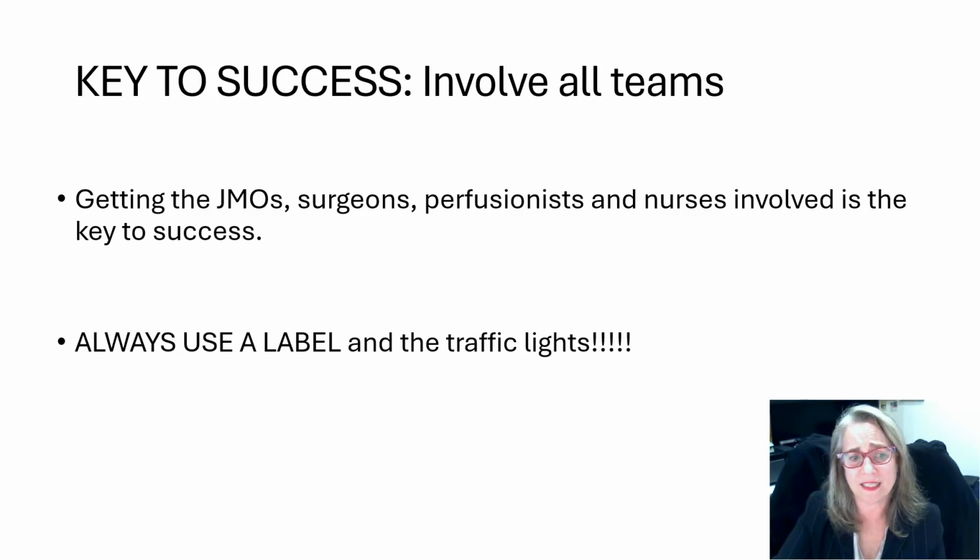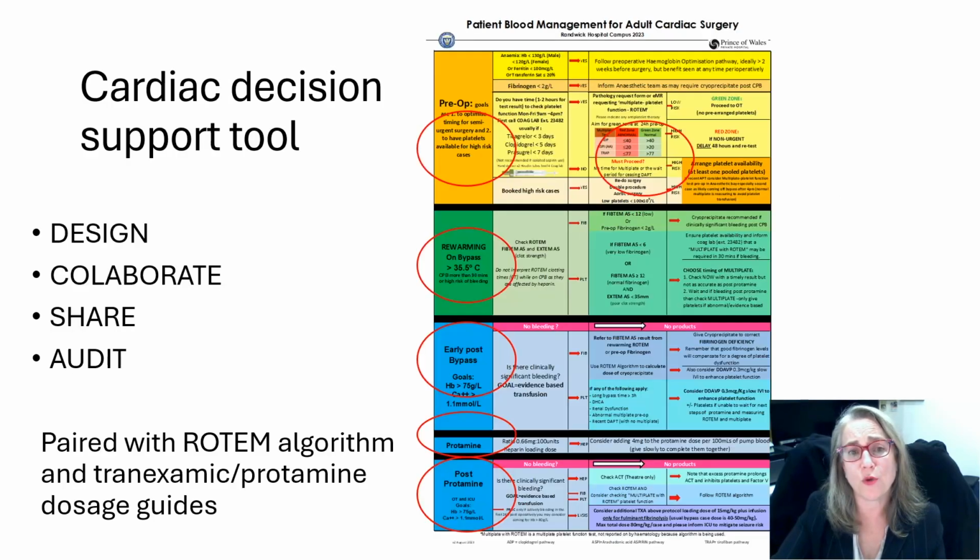So you involve all teams, get the JMOs, the surgeons, the perfusionists, the nurses, everyone involved. It's the key to success. Always use a label so there's good communication and handover. Always use the traffic lights so that you know when to transfuse and when not to.